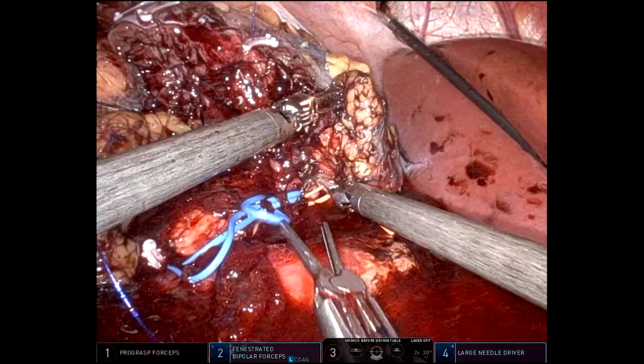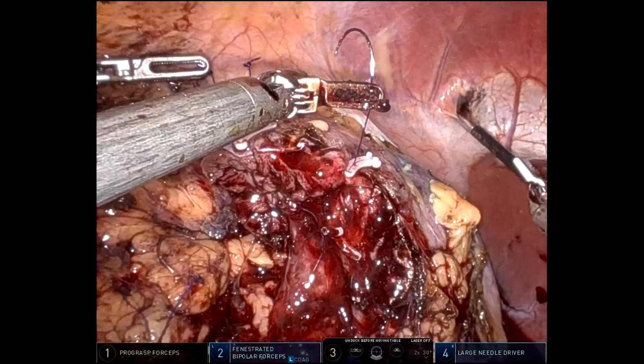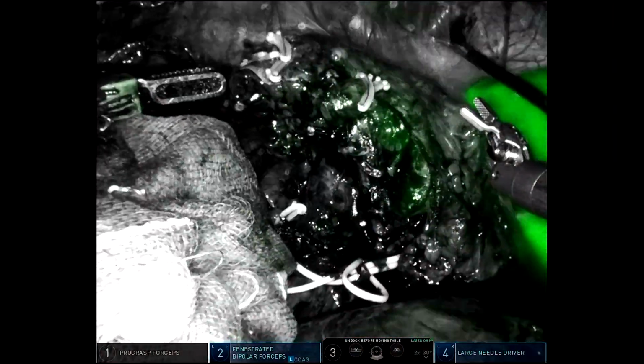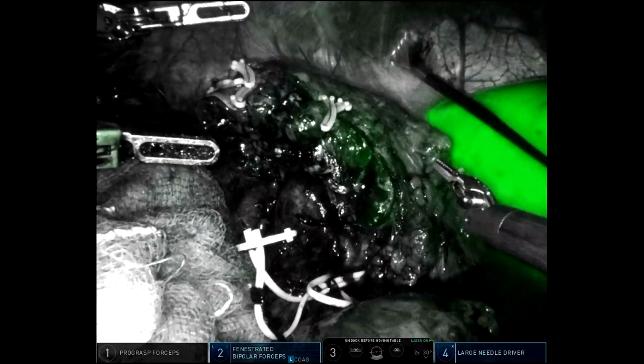The resection bed was again inspected for bleeding, and once hemostasis was confirmed, the renorrhaphy sutures were further tightened, and an additional Hem-o-lok clip was placed, to prevent slippage and maintain compression. Once again, Firefly mode was activated, to assess renal perfusion following clamp release, and to inspect the resection bed, for any non-perfused areas of residual tumor.